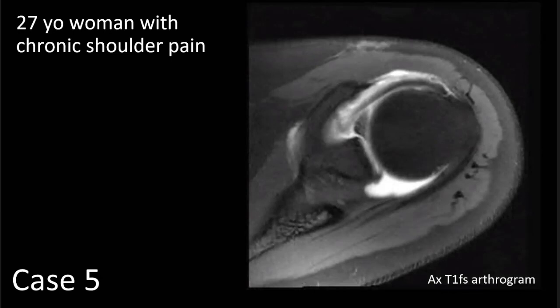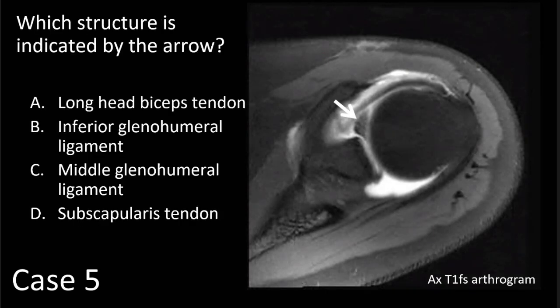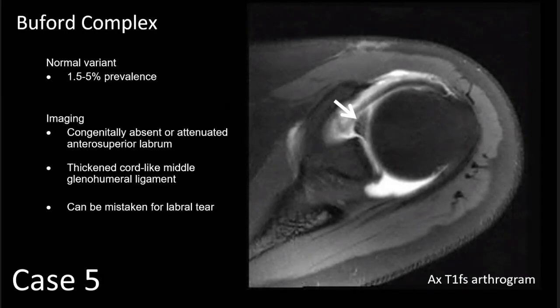Our next case is a 27-year-old woman with chronic shoulder pain. On this axial MR arthrographic image of the shoulder at the level of the coracoid process, superior glenoid, and superior humeral head, we see normal glenoid cartilage and normal posterior labral tissue. But anteriorly, there is a linear plane of contrast separating the bone from a relatively thick triangular-shaped low-signal tissue, indicated by the arrow. The question is: which structure is indicated by the arrow? The answer is the middle glenohumeral ligament. This is a case of Buford complex, a normal variant with a reported prevalence of between 1.5 and 5%. On imaging, you'll see congenital absence or attenuation of the anterior superior labrum and a corresponding thickened cord-like middle glenohumeral ligament.